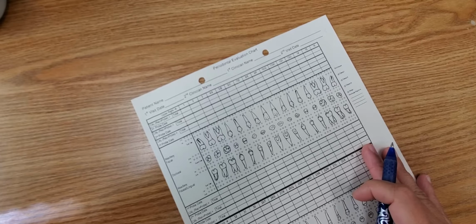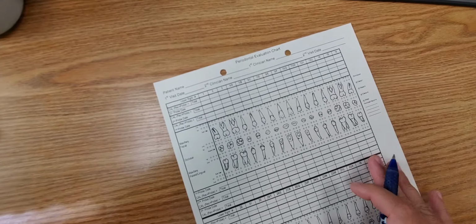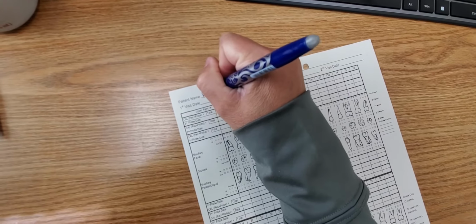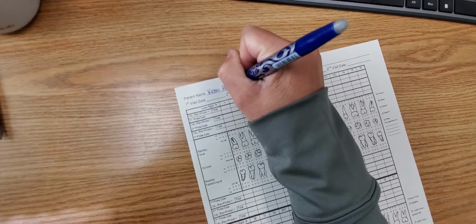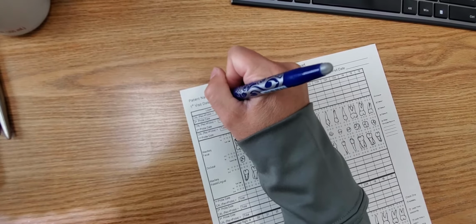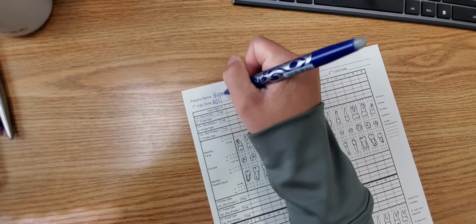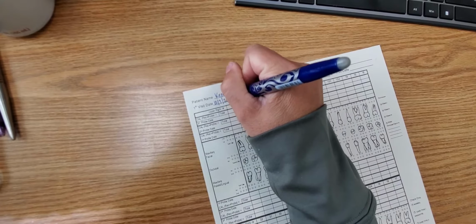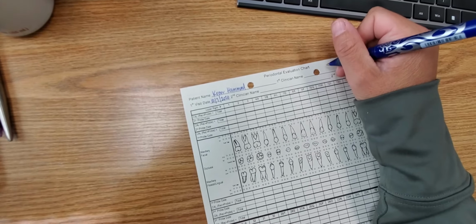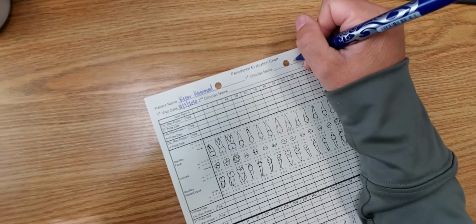These are the steps of perio charting. First thing you'll do is write your patient's name at the top. You'll then put the first visit date, and your name as the first clinician name if you're using this form for the first time.